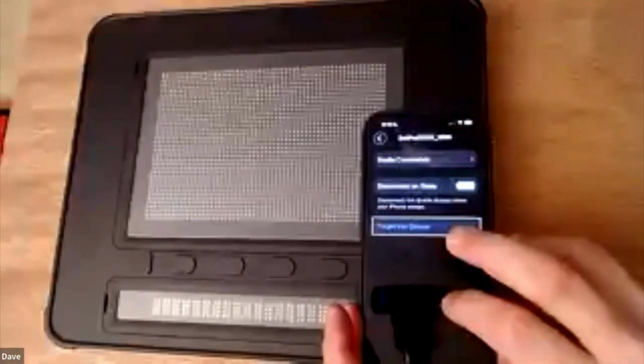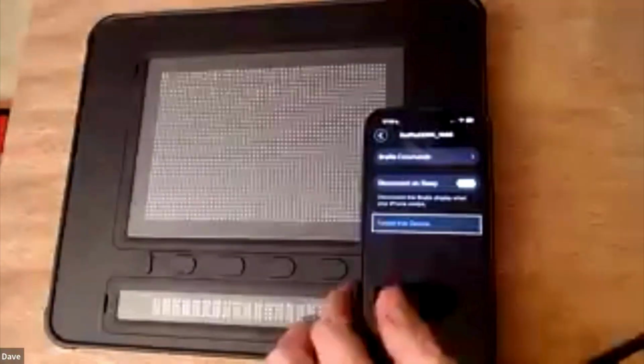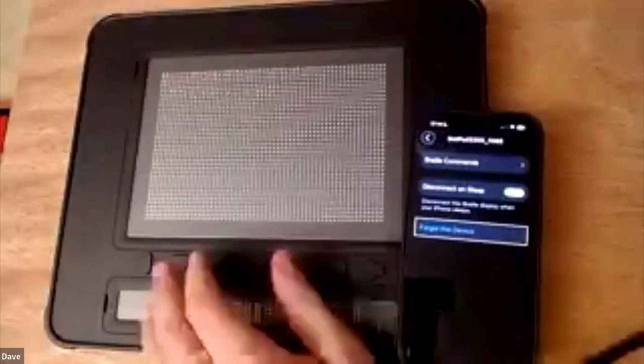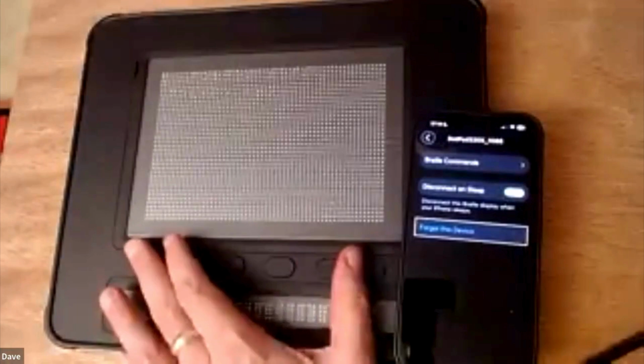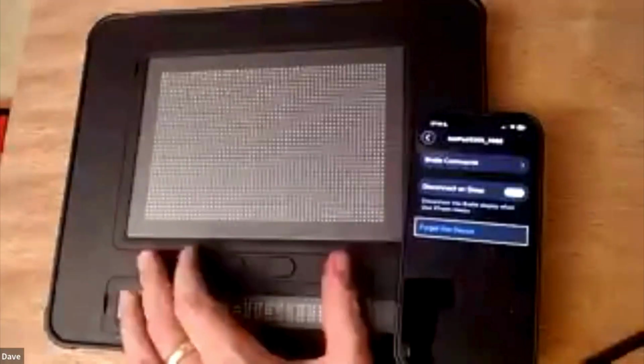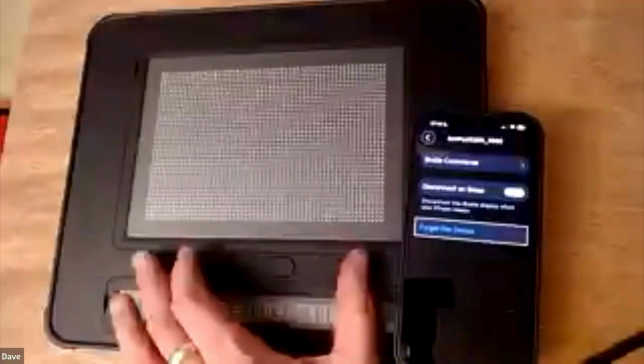The other thing I want to show you in this dialogue is how we assign our buttons. So just let me talk you through, and I will remind you of these. You might want to make some notes, but I will remind you of how these buttons work. So I talked about a row of 6 navigation buttons on the dot pad. So we've got 2 arrow keys and 4 function keys.